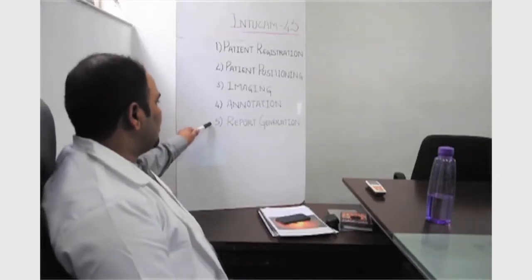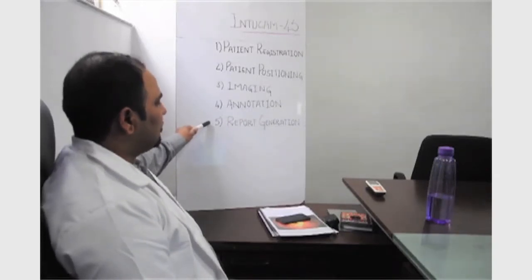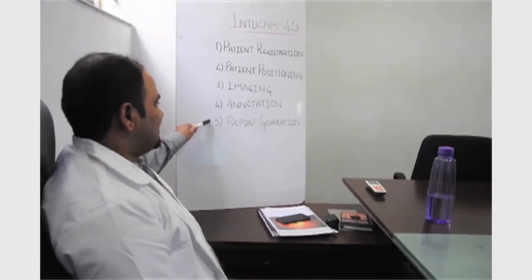Now the last step, report generation. Here I will demonstrate how to write your findings, print the report, and file it as a patient record.